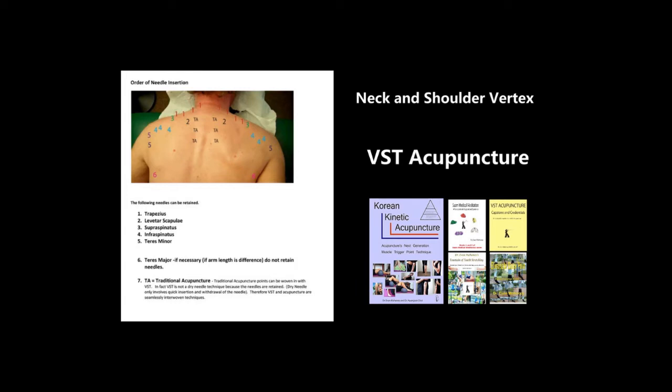I do not retain the needles on that one, but I will retain the needles on all these other trigger point needles. That's my technique. I'll use additional acupuncture points along the urinary bladder line. I'll use GB20 up at the base of the neck, and I can retain the needles from 5 to 10 or 20 minutes or 25 minutes or longer under a heat lamp. We love the warmth. So yeah, also use traditional acupuncture technique.